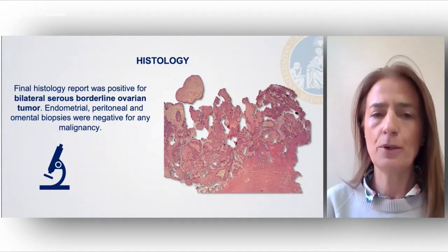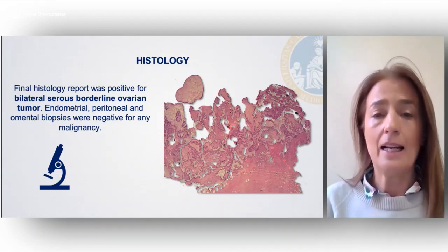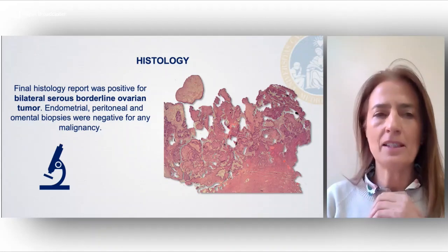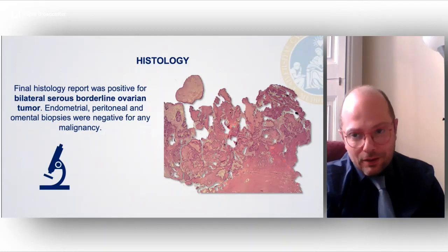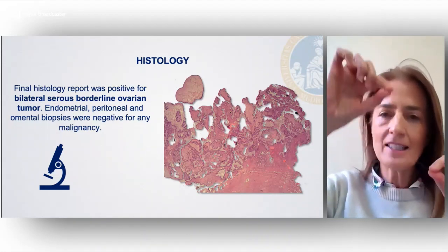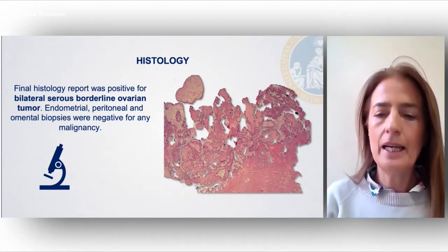Bilateral serous borderline ovarian tumor. So please remember that within the borderline there are atypias, there is no stromal infiltration, and there is a sort of, how do you say in English, Ahmad? Hierarchy, exactly. An organization. That's why, if we check the vascularization correctly, we can see vessels penetrating perpendicularly, because it's not so bizarre like high-grade serous carcinoma.